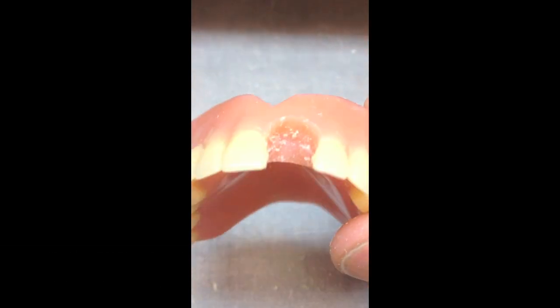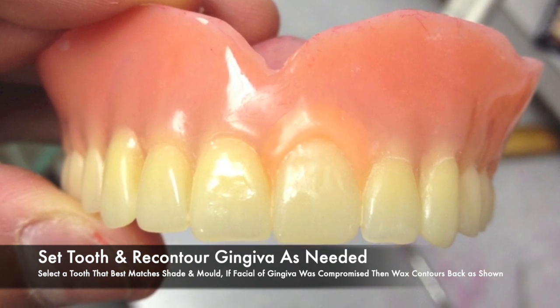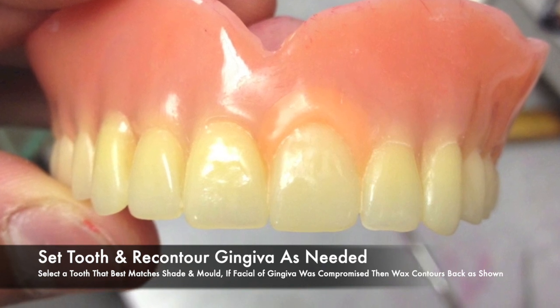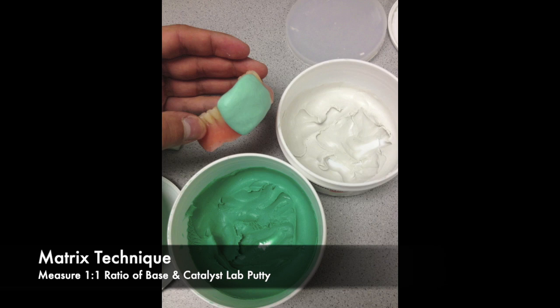With the facial of the gingival anatomy gone, it is important to set the tooth in wax and recontour the gingival anatomy. Once the tooth is set properly and the gingival anatomy is contoured properly, we can then use a matrix. The matrix technique uses one part catalyst, one part base — lab putty.